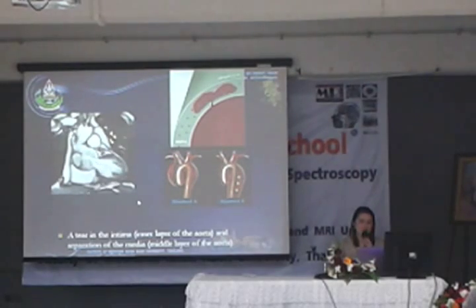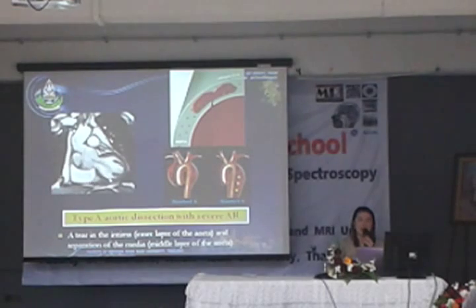The next example case was referred for cardiac MRI for grading severity of aortic regurgitation. At the scan, we noticed that this patient has a flap and aneurysmal dilatation of the aorta. This is a patient with type A aortic dissection, which is a tear of the tunica intima, the inner layer of the aorta, and the blood can pass through this tear into the tunica media. This patient involved the ascending thoracic aorta, which is Stanford A.